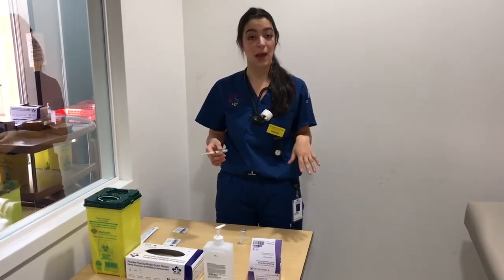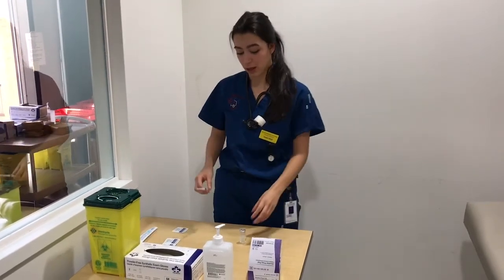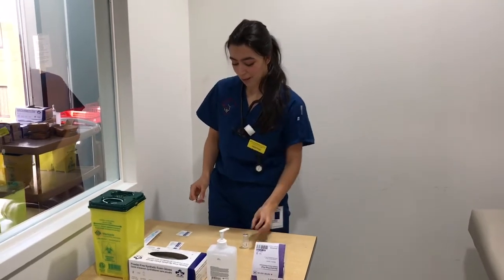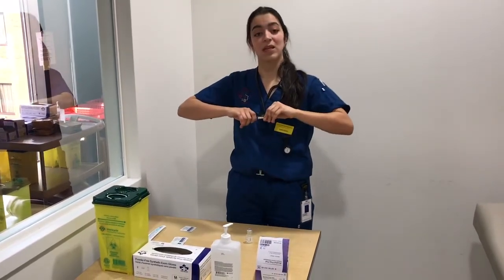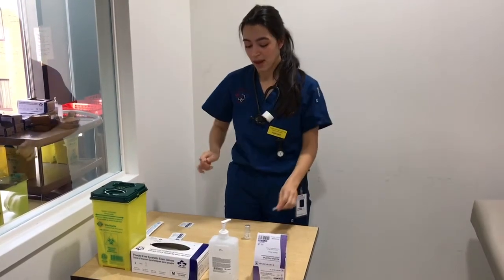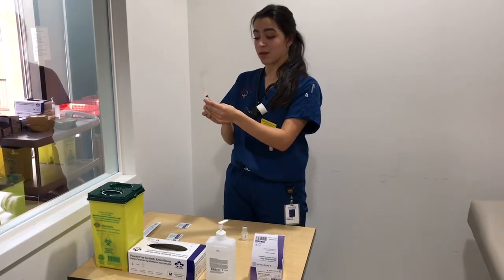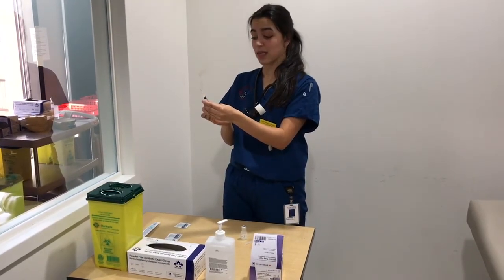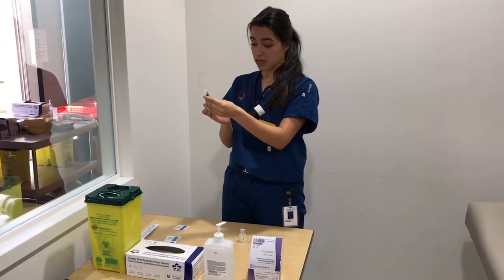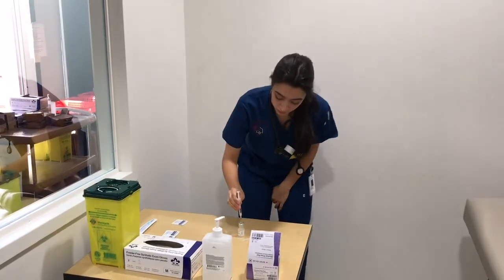So next what you're going to do is check the MAR and ensure that you're giving the right amount of medication. In this case, for my patient, they need 1 milliliter of sodium chloride. So what I'm going to do is open up the needle with my arms at a 90-degree angle and pulling away from me. And then I'm going to draw up the amount of medication that I would need, in this case 1 milliliter, in air, because I'm going to be injecting that into the vial to create positive pressure.